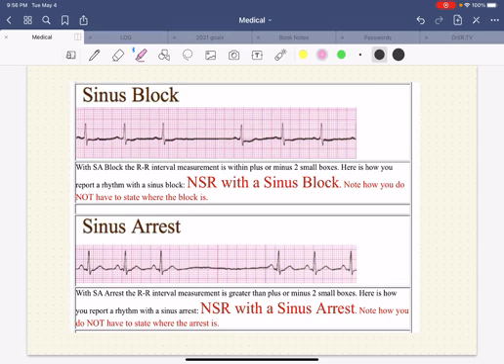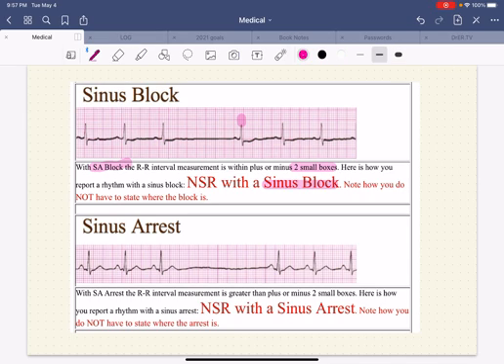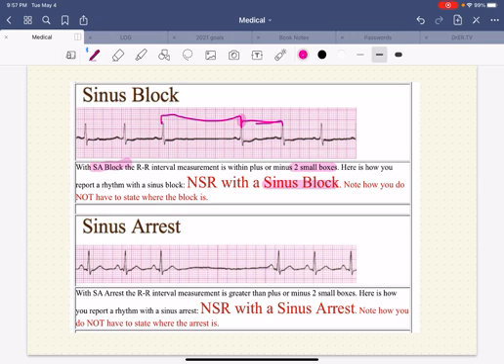There's a difference between a sinus arrest and a sinus block. With a sinus block, the RR interval measurement is within plus or minus two small boxes. Here is how to report a rhythm: 'normal sinus rhythm with sinus block.' What that means is that the difference between this interval and this interval is less than double what it was, and definitely less than two and a half seconds. A sinus arrest, on the other hand, has an interval measurement greater than plus or minus two small boxes. So if it's less than two boxes, then sinus block; more than two boxes, then sinus arrest.